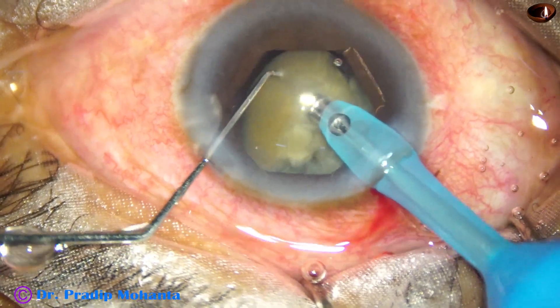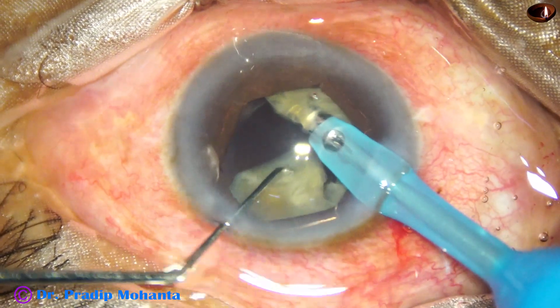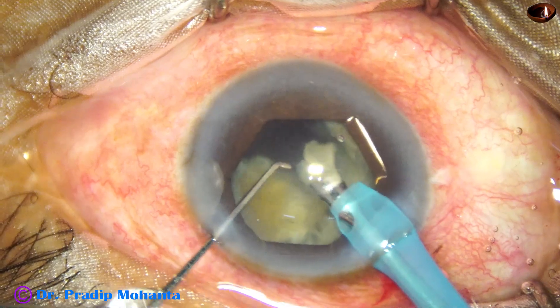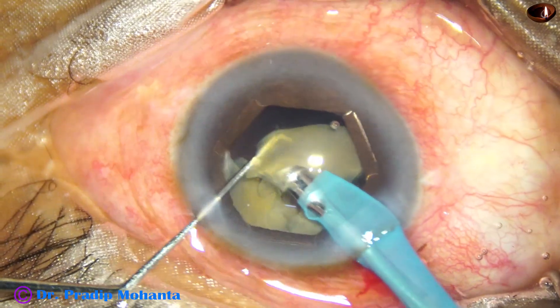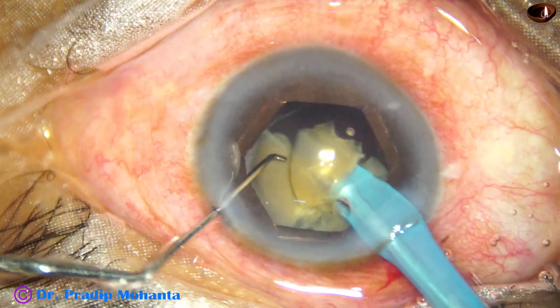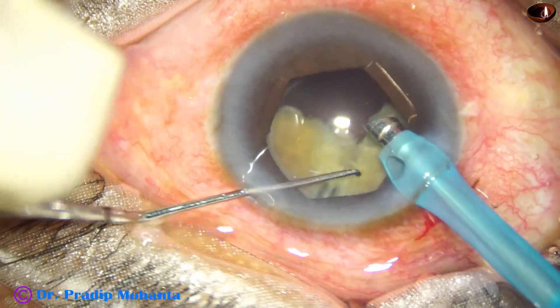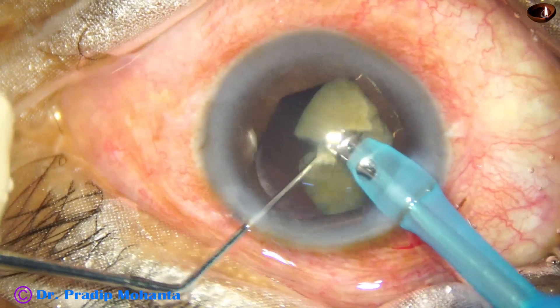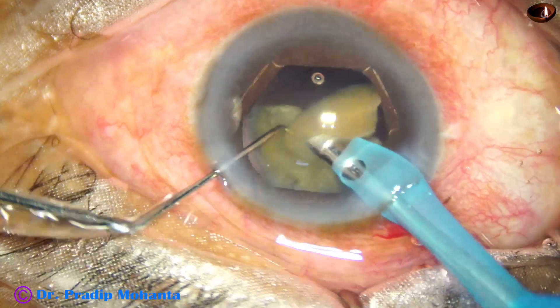Each fragment is held with vacuum and the chopper is used to divide it into smaller pieces. One fragment is below and another fragment is above at the iris plane. The fragment which is down is protecting the posterior capsule, and the fragment which is above is being emulsified into pieces.